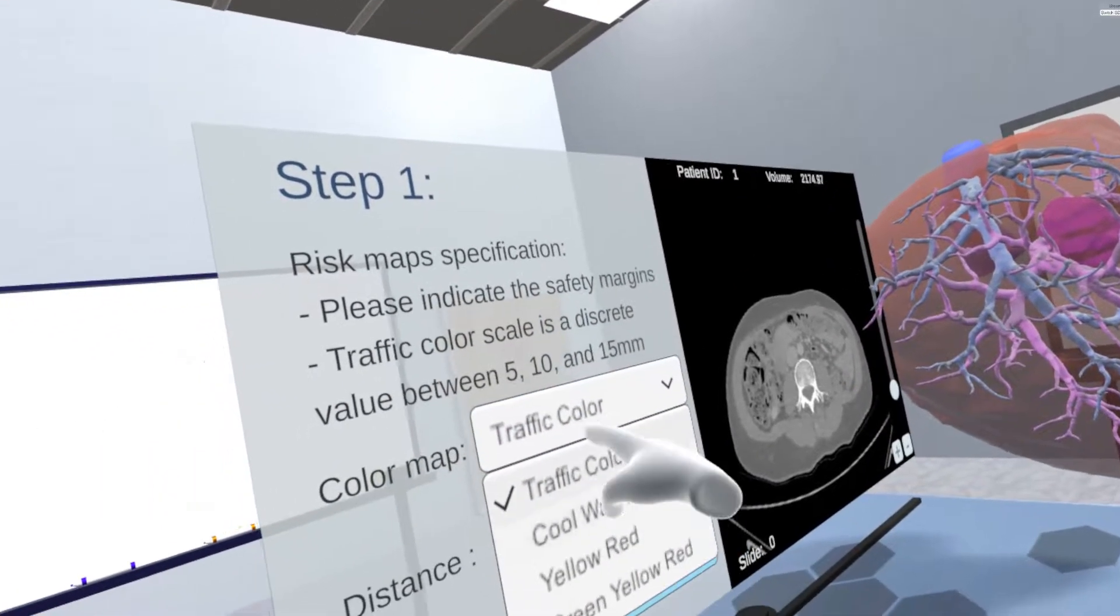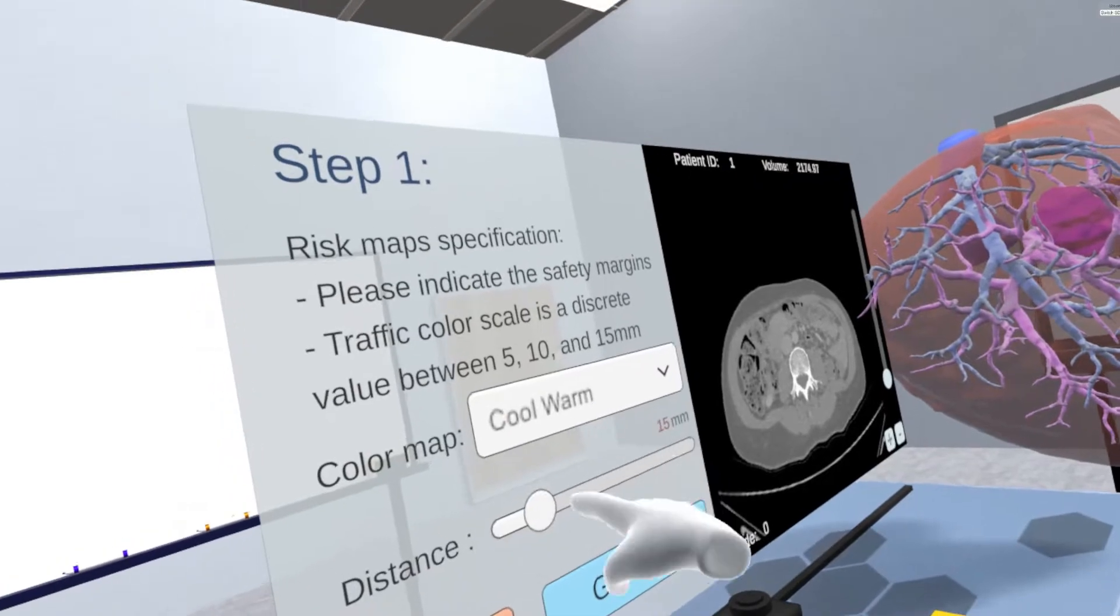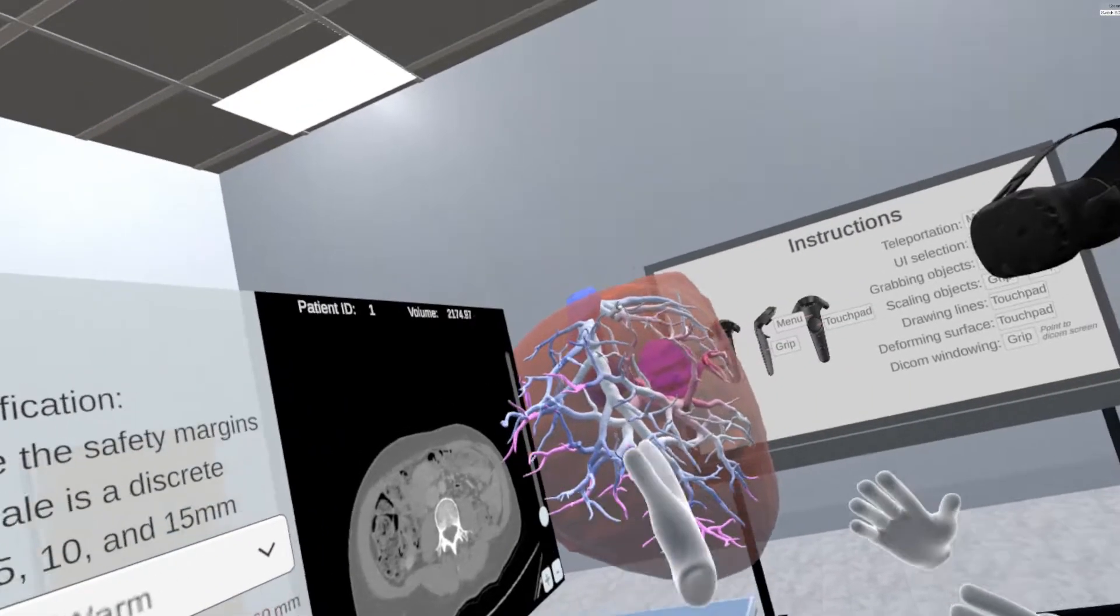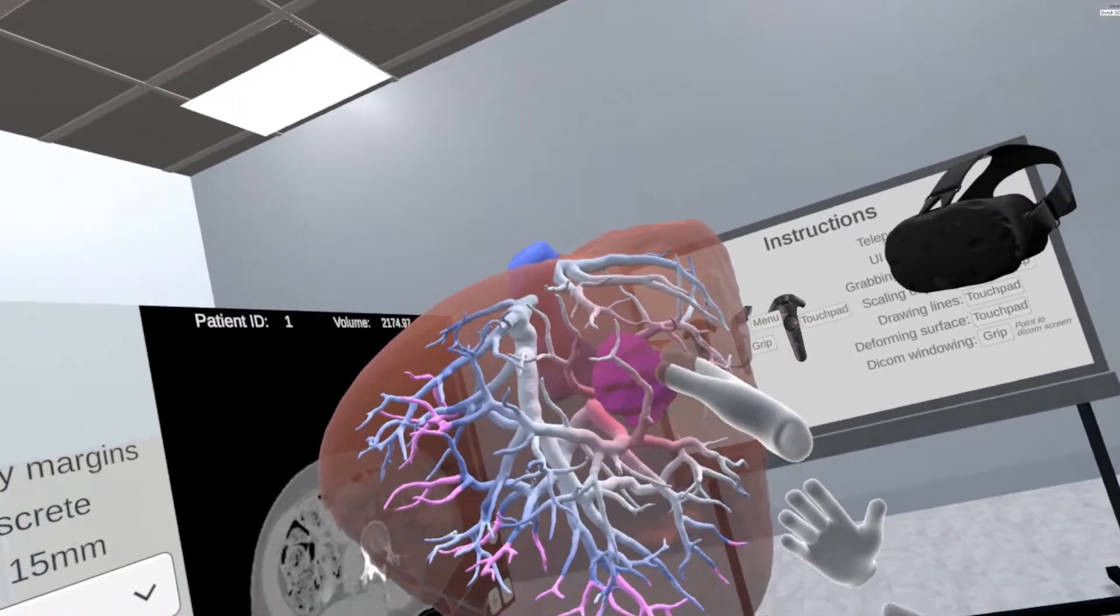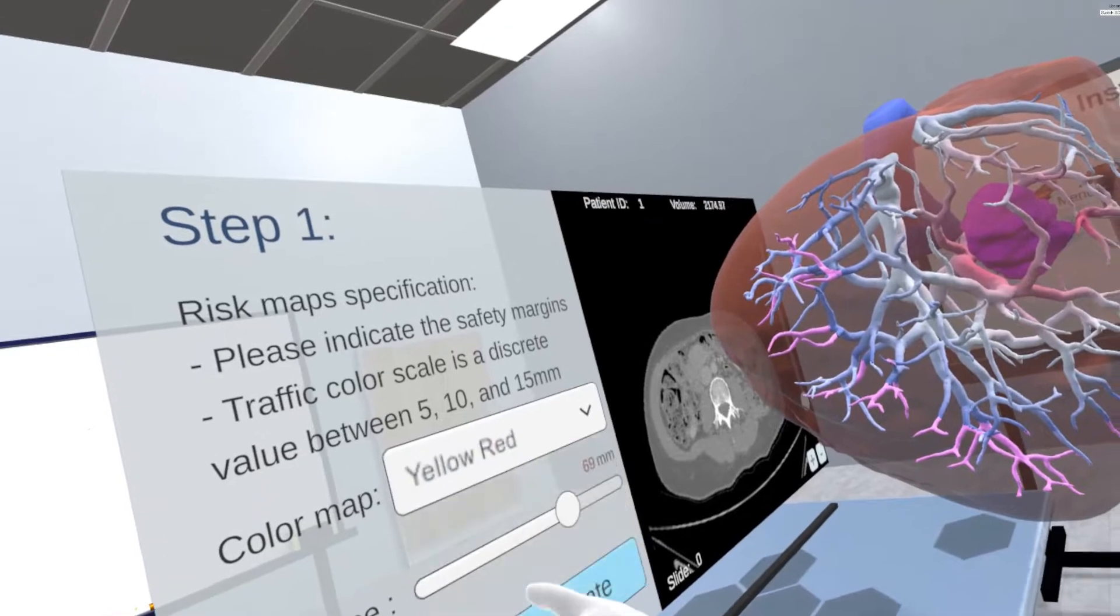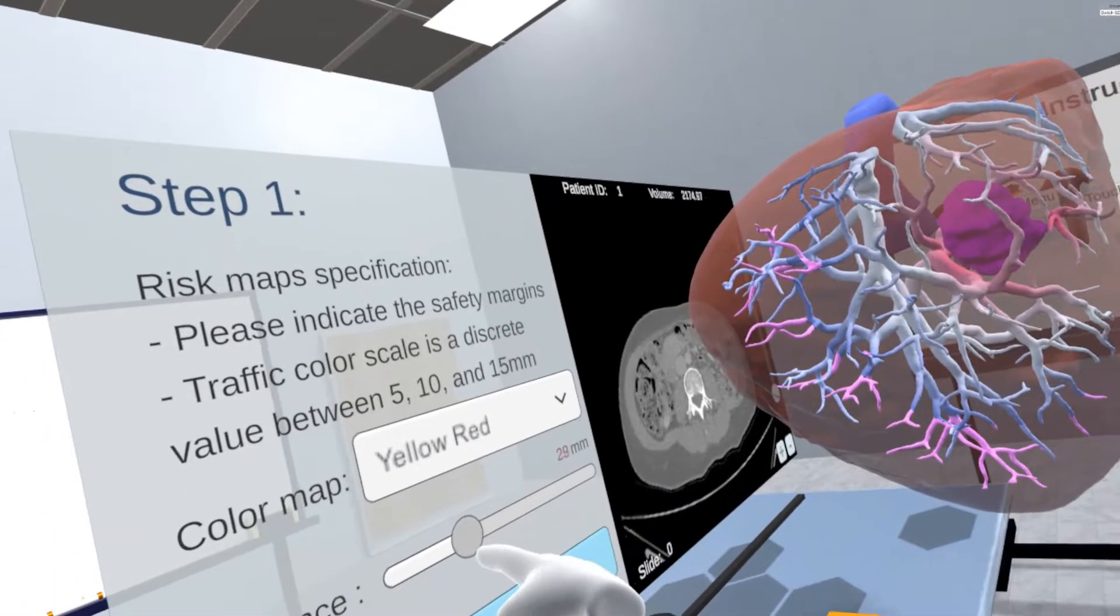We provide four color maps for risk maps visualization to support the users in assessing the distance from the tumor to surrounding vascular structures. They have options to preview and generate the visualization based on a given distance value to the tumor and a color map.